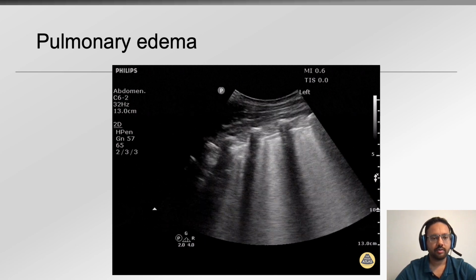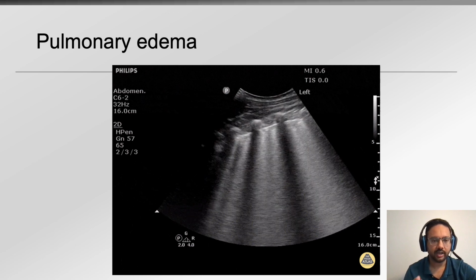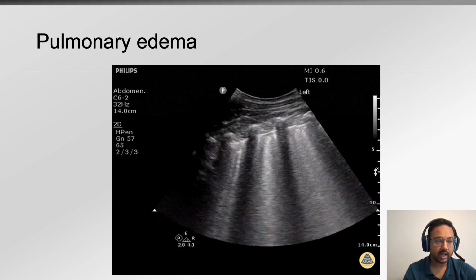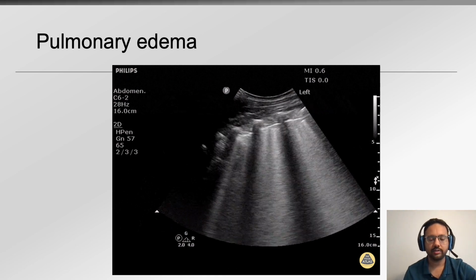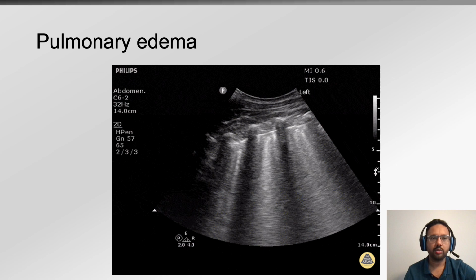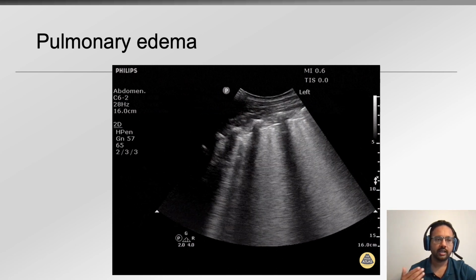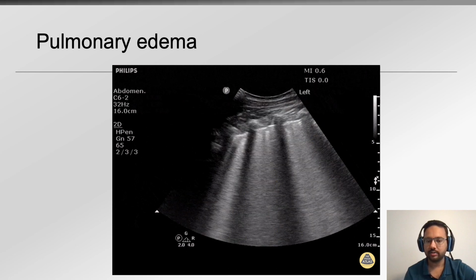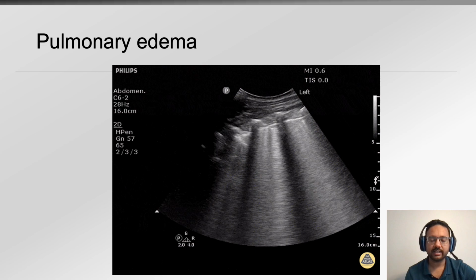While it's great to look at all these different diagnoses one after the other, I also think that generally when we are examining the lungs or any other organ system, we don't always have a diagnosis in mind. Sometimes we are getting through our physical exam and the history, and we're trying to figure out what the diagnosis can be.